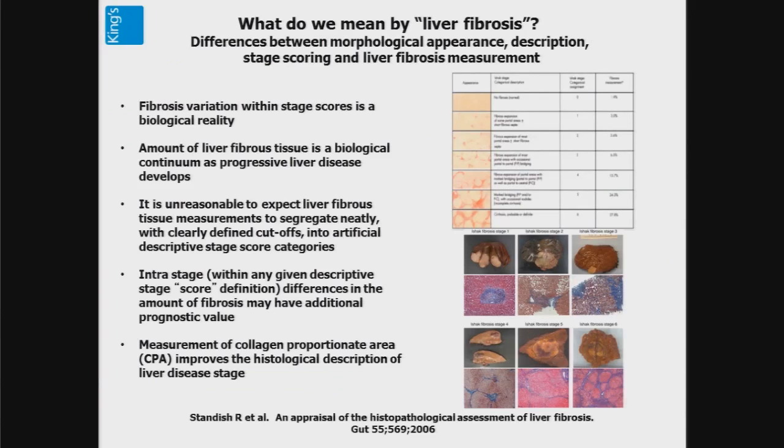So where are we with the actual measurement on biopsy for levels of fibrosis? Now, you're trying to look at a disease in continuity, compartmentalizing that into separate categories. So you're saying, this biopsy tells me it's a Metavir F3 and not an F4. But when you're giving a shear wave velocity measurement, you're doing it in continuity.